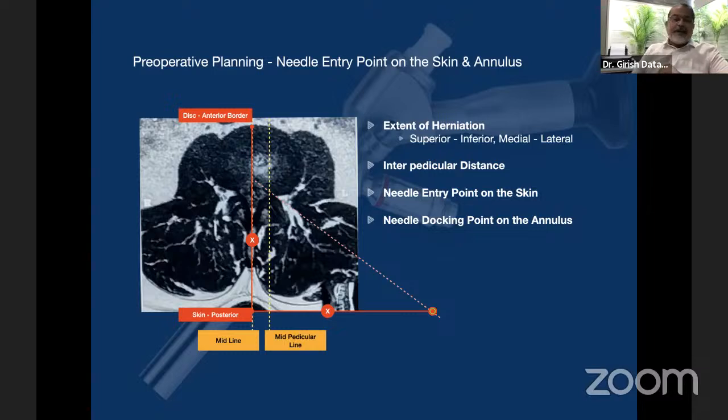And this is practically an epidural entry rather than an intradiscal entry. So doing this kind of entry in upper lumbar pathologies may be extremely difficult because of the proximity of the retroperitoneal space. You need very good paraspinal musculature which is extended laterally. So L4-5 is also difficult, but L4-5 you'll be able to do. And L5S1 with a shallow iliac crest is also possible.